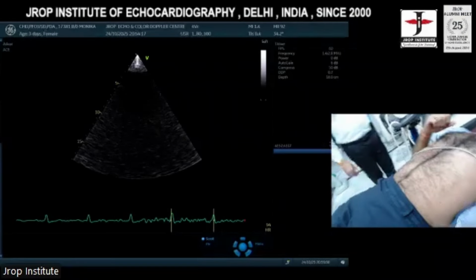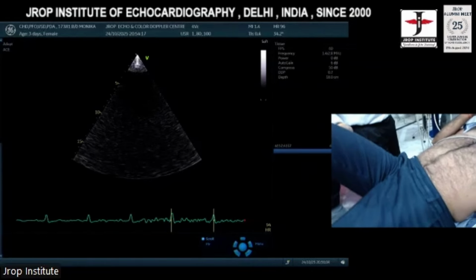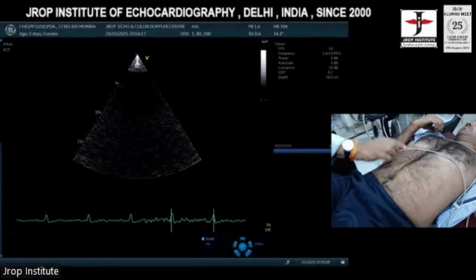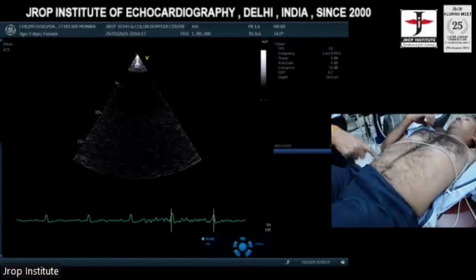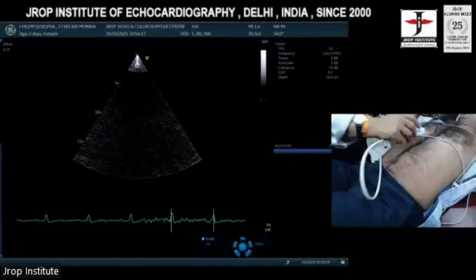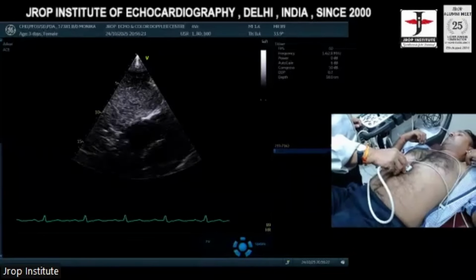The most important thing is that we don't let the patient lie down flat. Let him fold the legs. Look, he folded the legs. Let him relax his abdomen. Face the subxiphoid process and put your probe just near the subxiphoid process. I'll show you that. Now, this is my subxiphoid process, and the probe is right on the subxiphoid process.